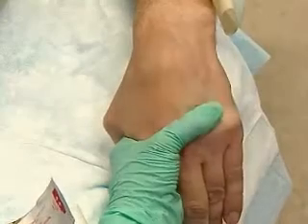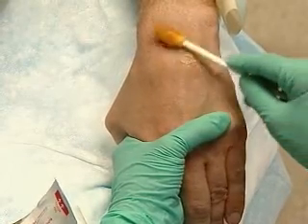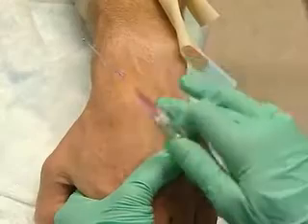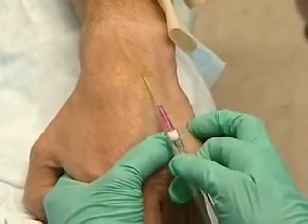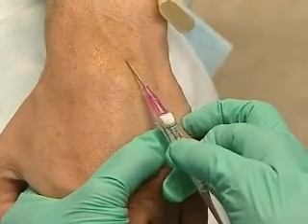This vein on the dorsal surface of the hand is the usual choice for the IV line. Prep the skin with alcohol or betadine. A little traction on the skin, a shallow approach to the vein, and the slight flashback into the needle shows that you're in.